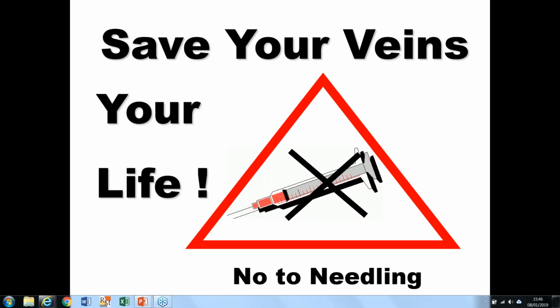So, like for any patient with a new fistula, our nurses would first needle it. Where possible, we try and create buttonholes, so we create the track for the fistula needling. And once that track is created securely, and the patient can move from sharp to blunt needles, it becomes a much easier teaching process and a much easier system for them to learn. And we try and follow that pathway. Sometimes the parents prefer to learn, even with young children. Even on our home dialysis program, we have parents who do this. So we try and build up that skill.